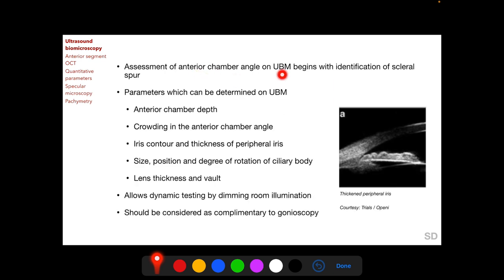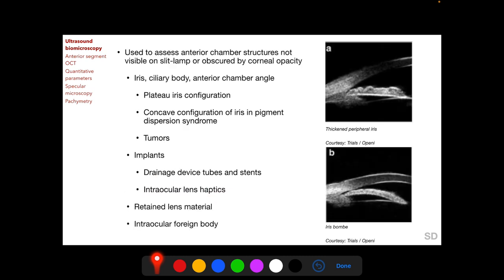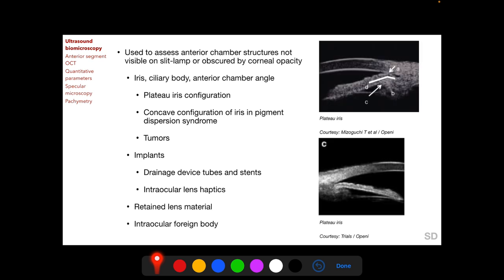Assessment of the anterior chamber angle on UBM begins with identification of the scleral spur, which is subjective and operator dependent. The scleral spur is located on the sclera adjacent to the anterior extent of the ciliary body. Parameters determinable on UBM include anterior chamber depth, crowding in the anterior chamber angle, iris contour and thickness of peripheral iris, size, position and degree of rotation of the ciliary body, and lens thickness and vaulting.